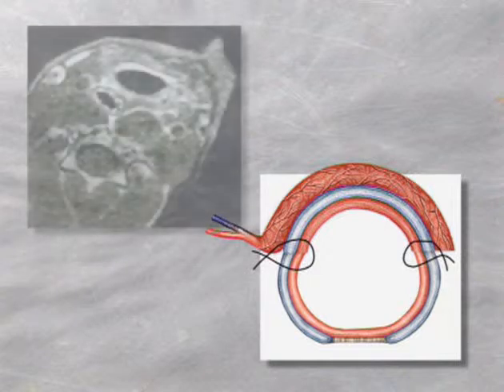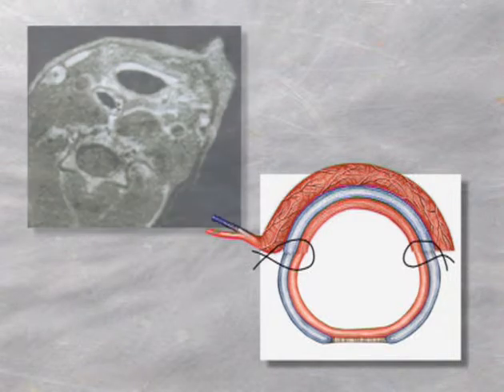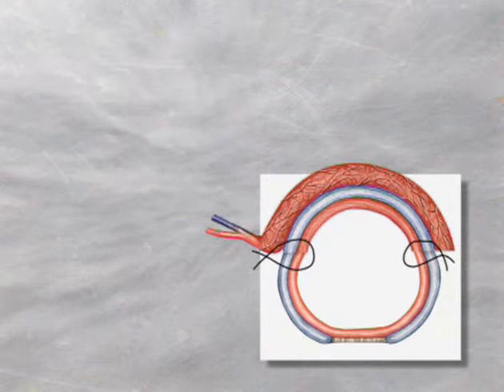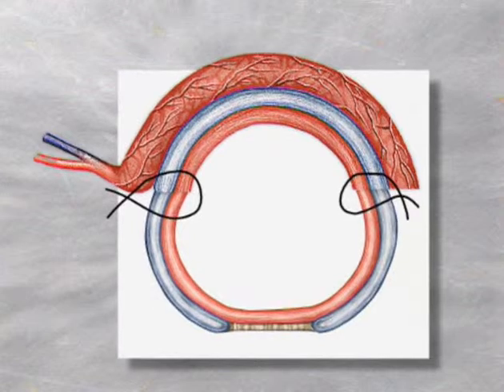An axial CT scan shows an anterior airway defect after reconstruction with a revascularized tracheal patch. This reconstruction can be evaluated macroscopically after injection of the vascular pedicle with blue microfill. The revascularized tracheal patch gives us the definition of the optimal reconstruction of an anterior airway defect.